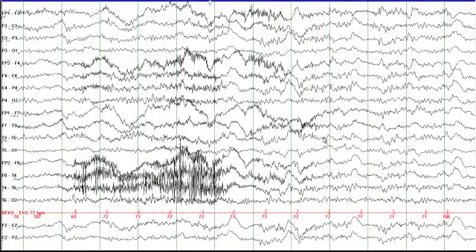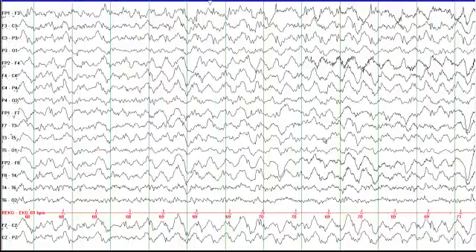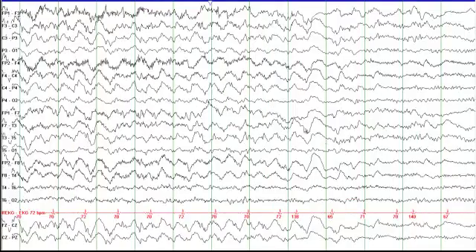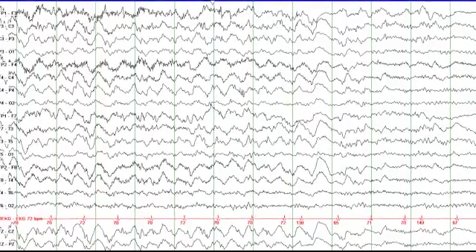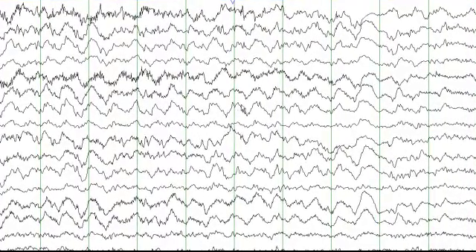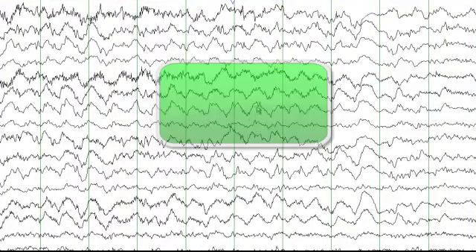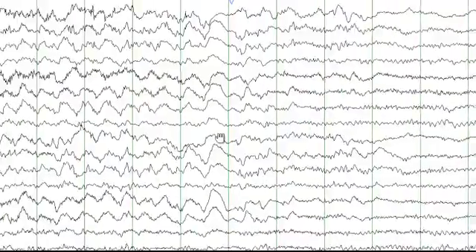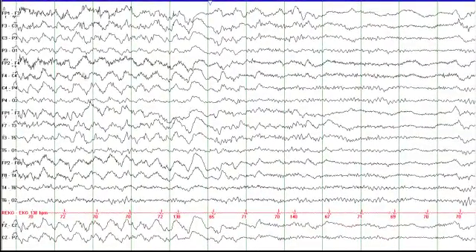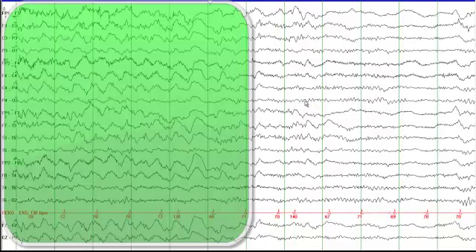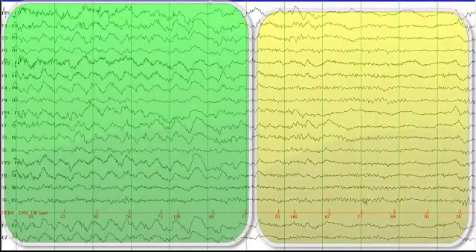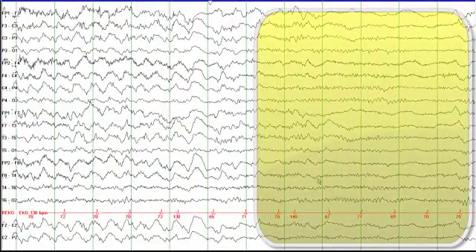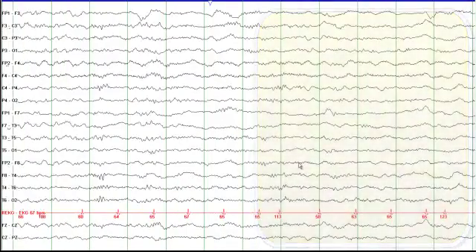This activity comes back again as rhythmic delta activity. Why call it delta? If you count the number of waves between these two green lines, you have approximately two waves per second. Then you can see the transition — all the slowing in the first half of the page, and then it resumes to almost alpha frequency at the end of the page. A very clear, discrete seizure.